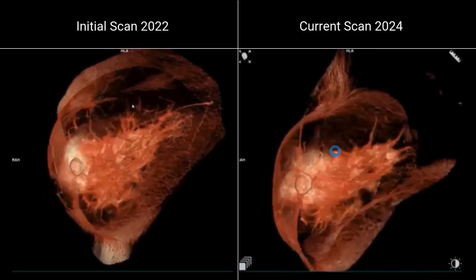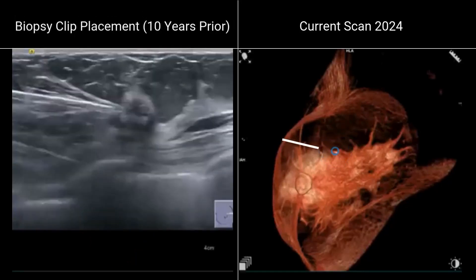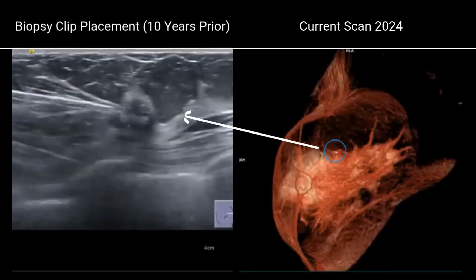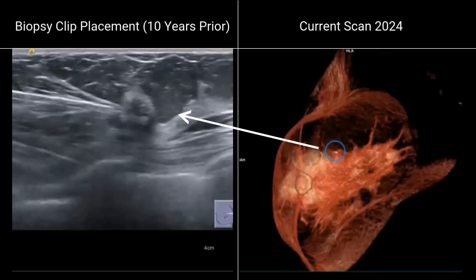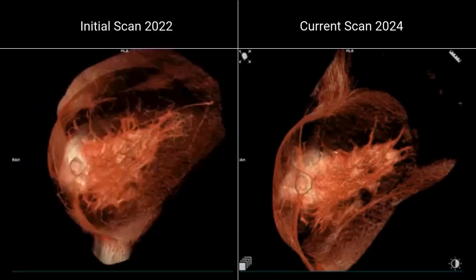You also have to be aware that there's one clip in the breast after a biopsy 10 years ago. This is the corresponding biopsy with the needle on the left side for the verification of the histologic findings.